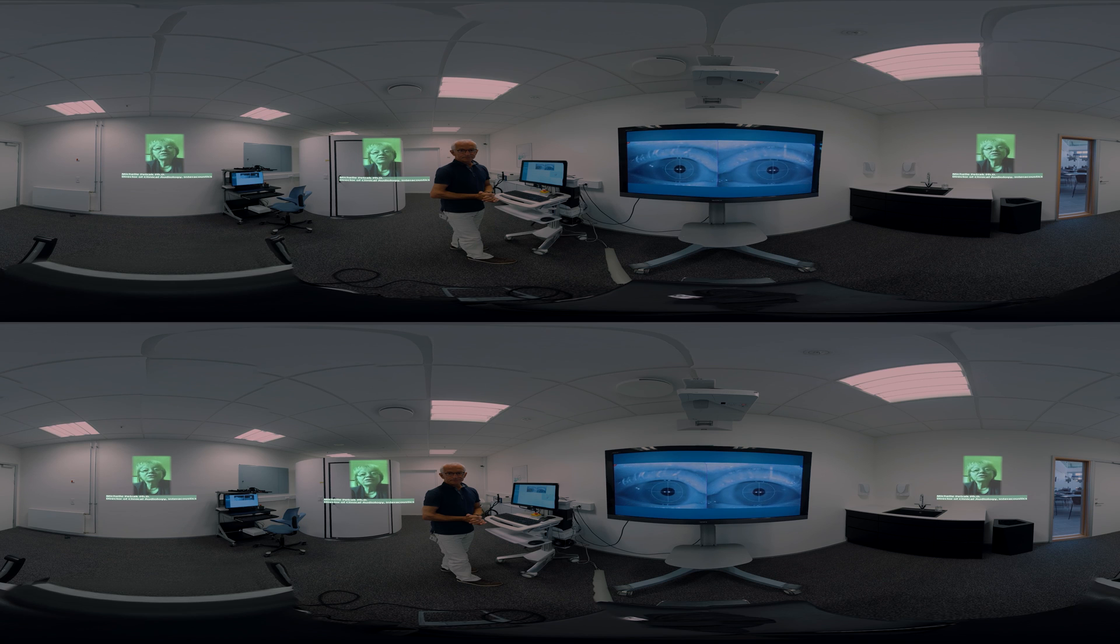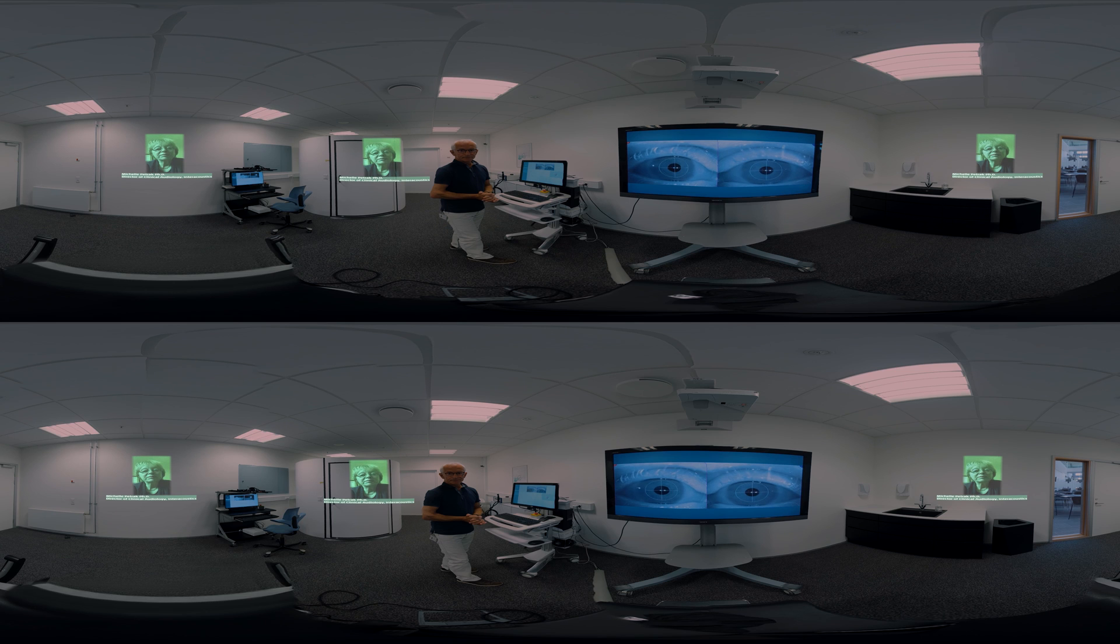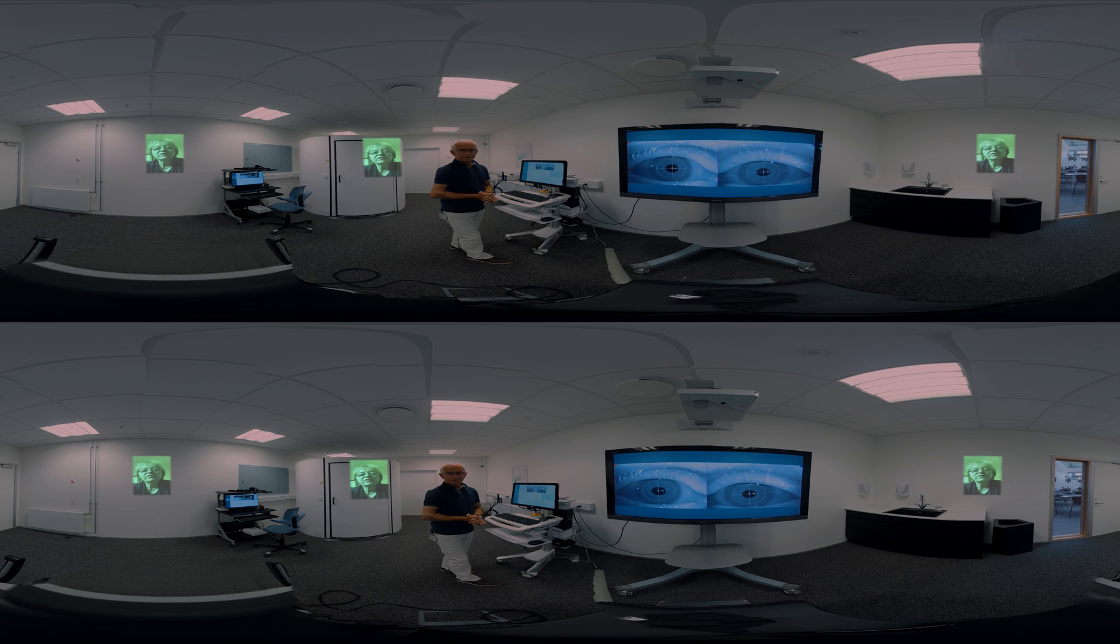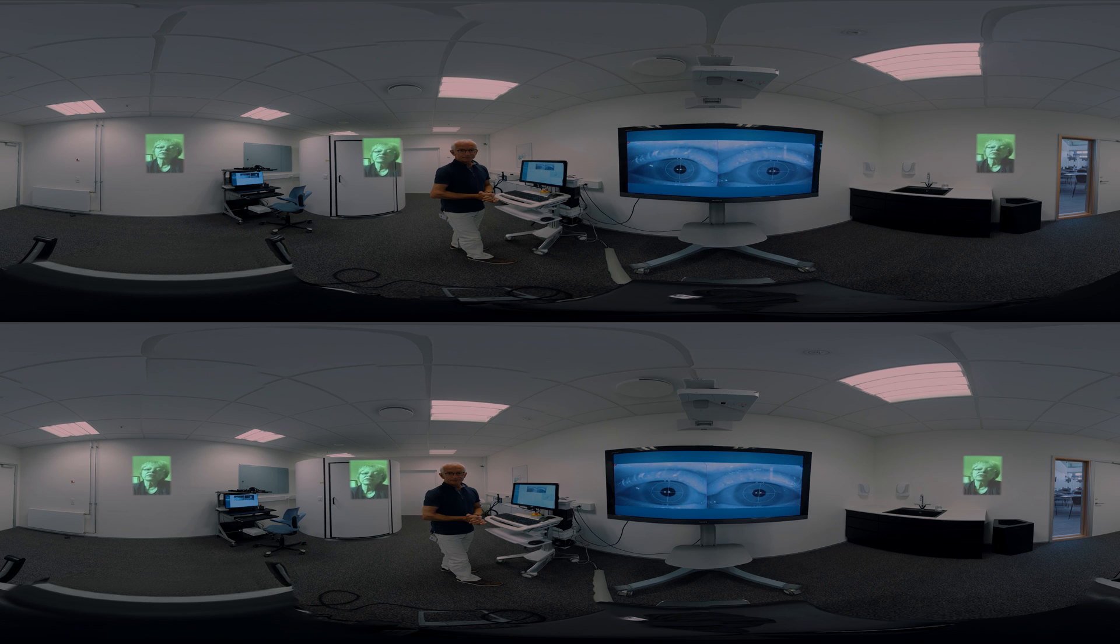For example, we've added a torsional nystagmus algorithm and this not only brings extra value to my Dix-Hallpike tests, my BPPV analysis, but it also provides me information on the otoliths, specifically the utricles, when doing the ocular counter roll test.